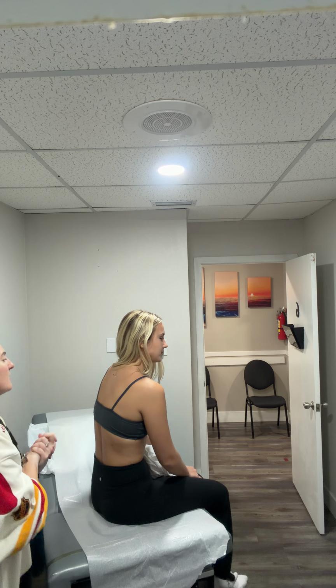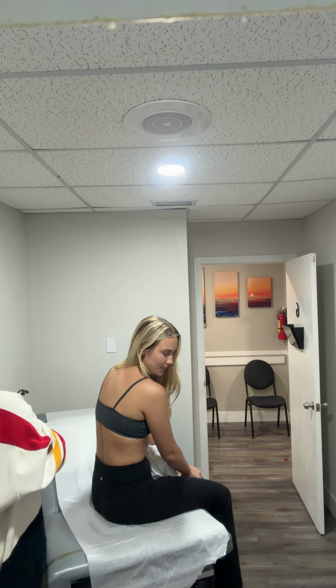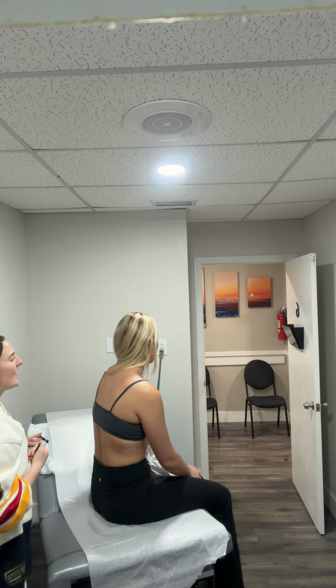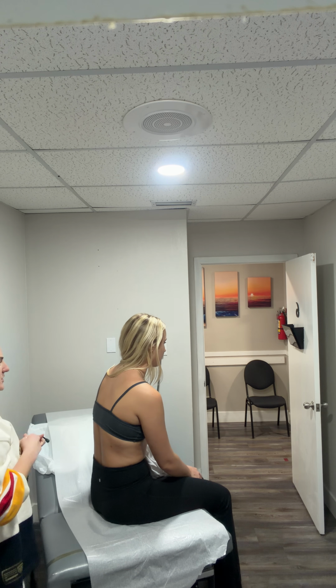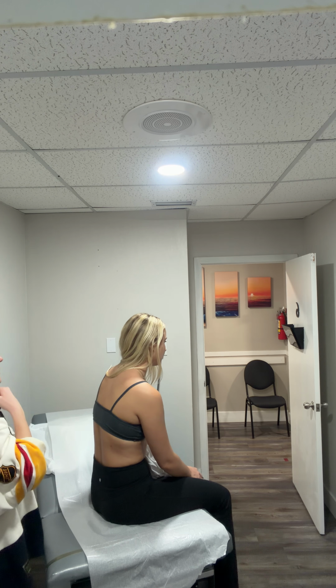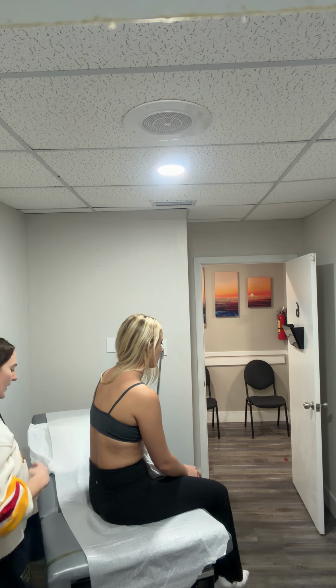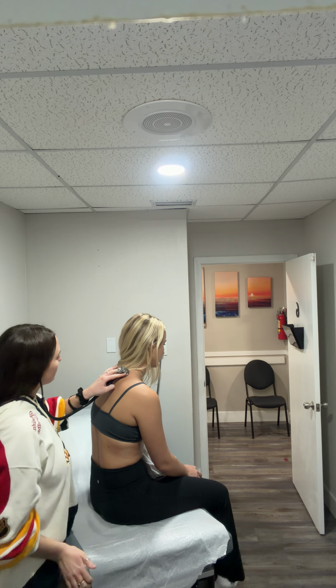Perfect. And now that we have percussed, I'm now going to auscultate in the same exact spots, noting any rhonchi, wheezes, or rales during one full inhalation and exhalation cycle. Okay, so when you feel my stethoscope go onto your skin, I want you to take one deep breath in and out for me, okay? In.